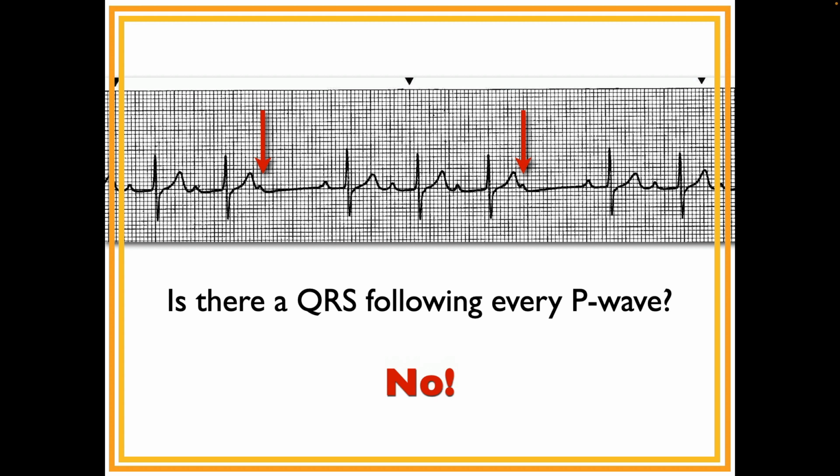Okay. And again, I don't expect you to remember that last bit. We're going to be doing that around Thanksgiving. But for now, the answer is you're not going to have an individual U wave with no other U waves, and it's the same shape as the other P waves.